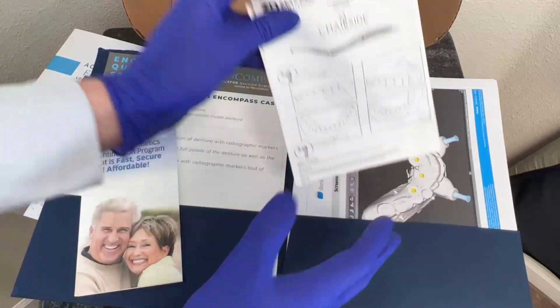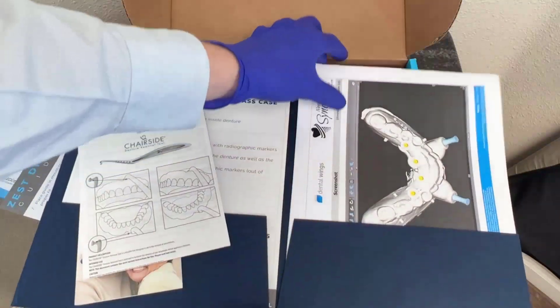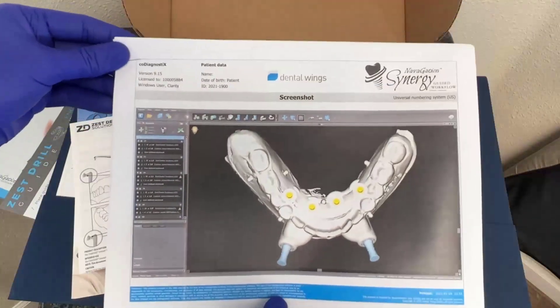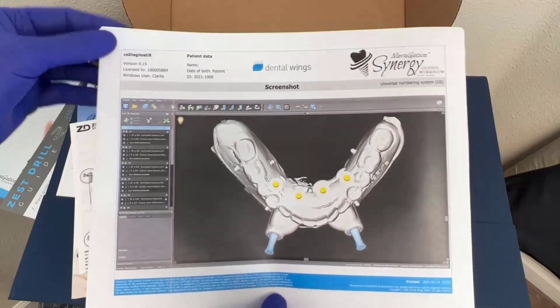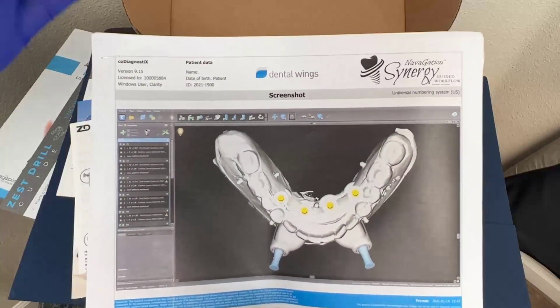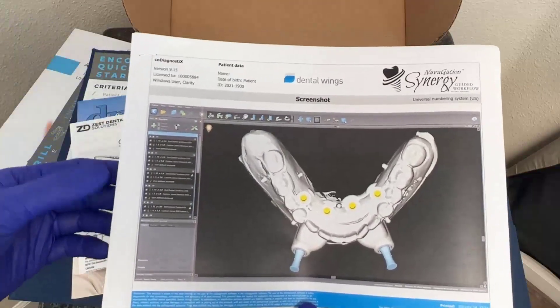We've also got a patient flyer that I can give to the patient about how to use the chairside Denture Removal Tool. And then finally, a very important packet of information that is specific to the implant surgical case. This is something that's very valuable — a service provided to us from Navigation Surgery Group. The Navigation Synergy team has put together this surgical guide and template based upon the workup that I've already done with Navigation.